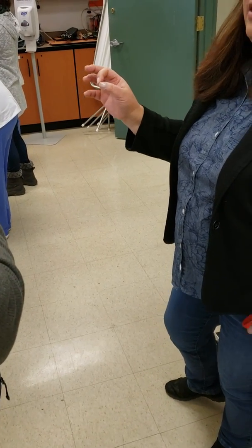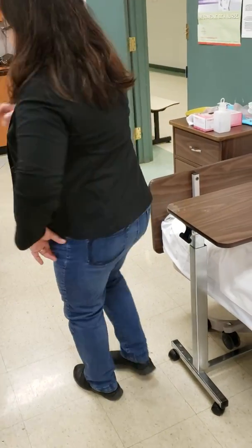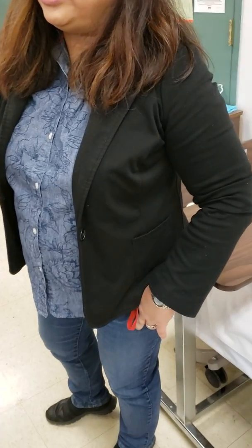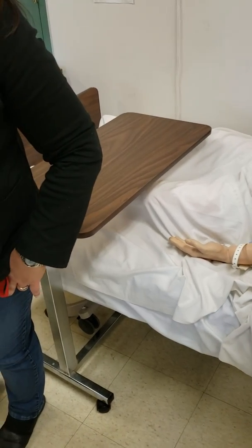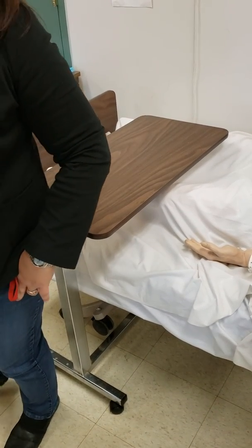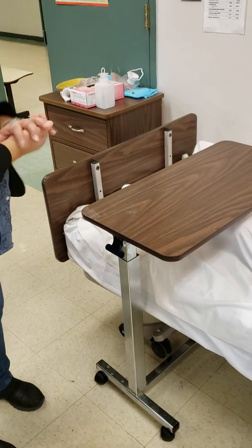Are gonna hang. All right, it's Jevity. That's the name of the solution, which I forgot to grab. And then the flow rate and the concentration, all the stuff, and the patient's name, of course, and the date of birth and everything, the date of order, like that. Okay.